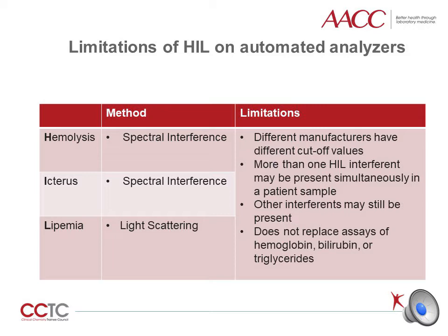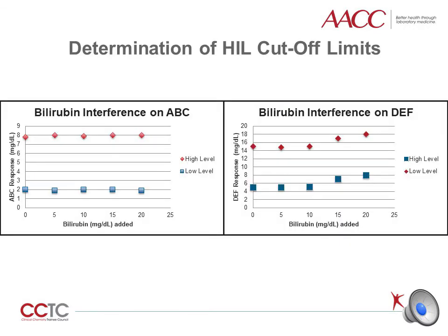HIL indices do not replace standard assays of hemoglobin, bilirubin, or triglycerides, since it is a nonspecific, semi-quantitative method. Analyzer manufacturers perform interference testing to assess potential HIL interferences on analytes. Various degrees of hemolysis, icterus, and lipemia are tested to determine if the result of an assay is significantly altered. Based on acceptability criteria of interferences, the manufacturer defines a cutoff value. In the example shown here, the response of the ABC analyte is not affected by increasing bilirubin concentrations. However, the same does not apply to analyte DEF — the DEF response changes with increasing bilirubin concentrations.